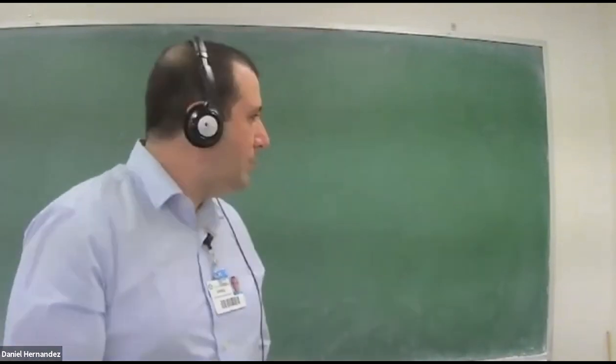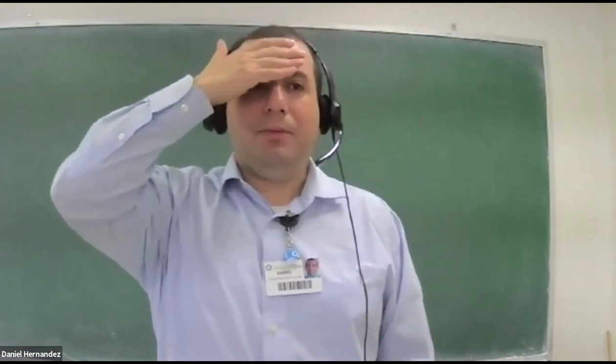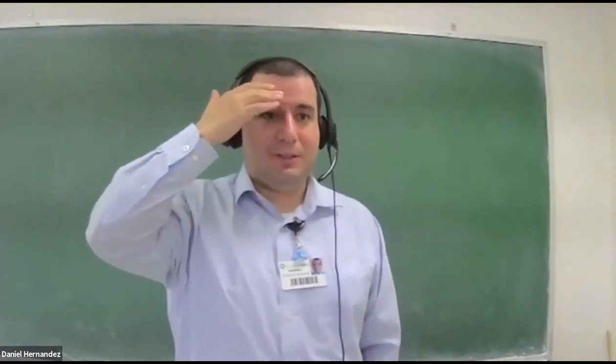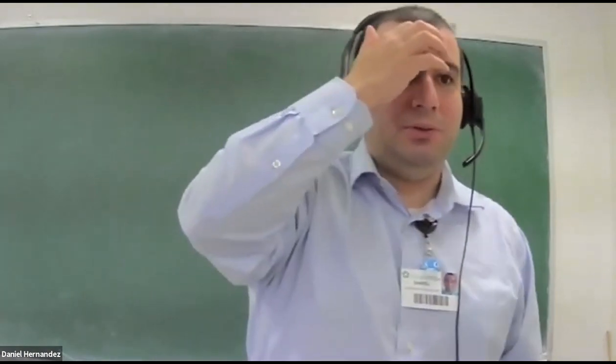Any questions about this type of exam? They're fairly easy to perform actually. I use the highest frequency probe that I have. Our lab liked us to use an 18 megahertz linear probe with a very wide footprint. It's the same one we'd use for a testicular exam, so you can see very superficial.